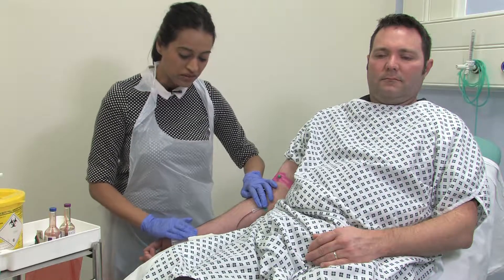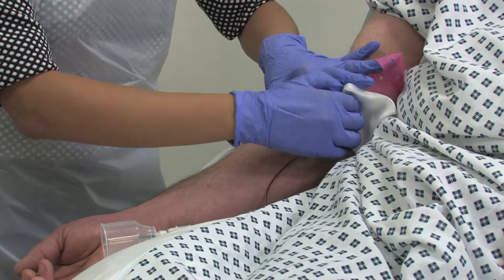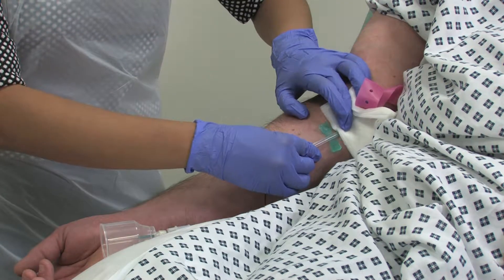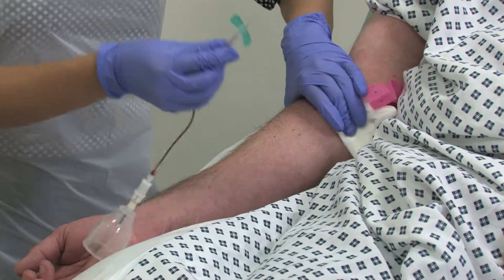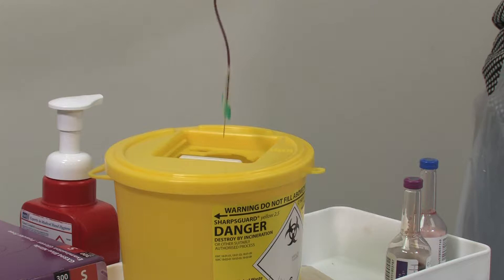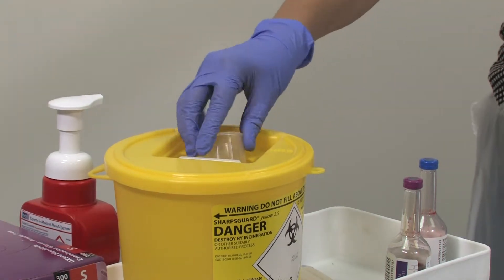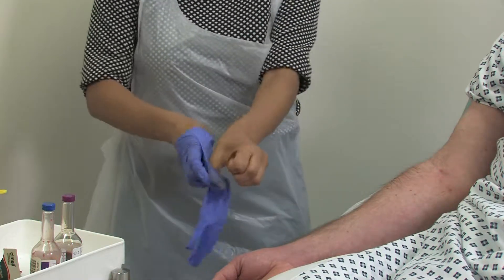Once all the blood has been collected, it's important that we release the tourniquet, apply some gauze and remove the butterfly needle. Once it's been removed, it's important that we discard this into the sharps bin with the adapter cap. We can now remove our gloves and apron and wash our hands.